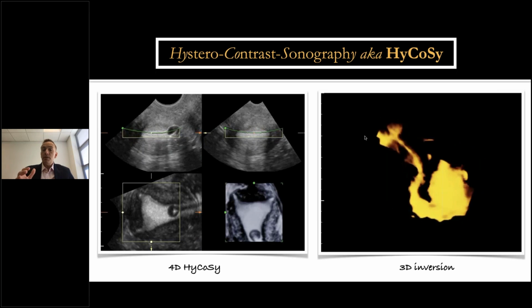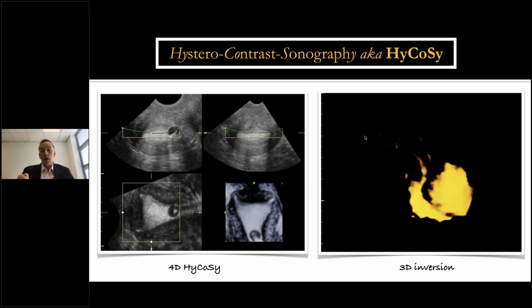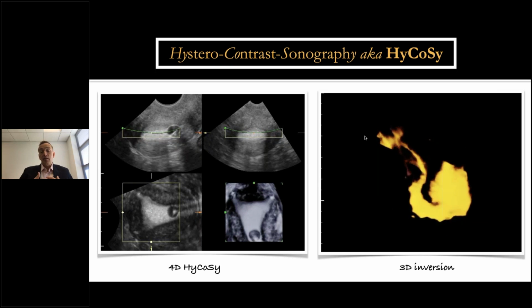It's a very easy procedure, but you've got to be very good at scanning because it's all about very subtle movements of the ultrasound probe, very tiny micromillimeter movements to the left, to the right, so that you can track that fallopian tube, which we know has a convoluted flow to it. So you're unlikely just to see it in one plane.